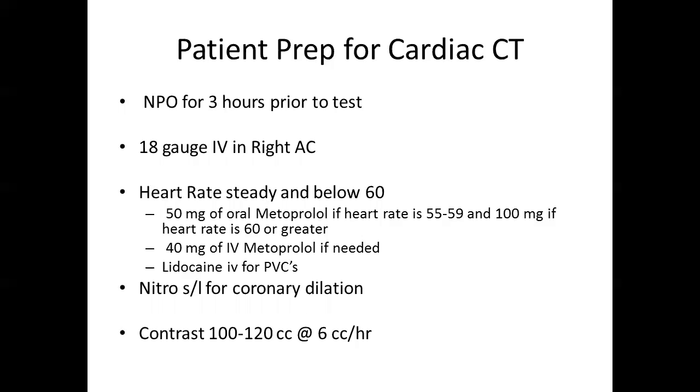So we'll give a lot of metoprolol. When I started doing CT, I was like, holy shit. After this, when you get called on the floor, the nurse is afraid to give like 5 milligrams of metoprolol. So we give usually 100 milligrams as a single dose. If nobody has taken a beta blocker before, we'll give them 100 milligrams.